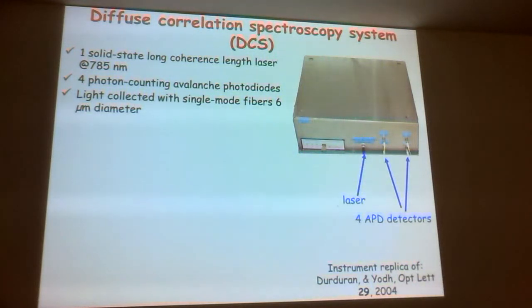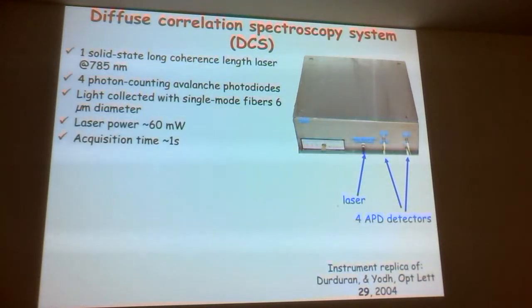Yeah. So when we do the measurements of Doppler, we do not measure in a single photon mode, and thus it's an analog signal, meaning we have a signal that's already averaged. When we use diffuse correlation spectroscopy, we look at single photon fluctuations in terms of intensity, and this technique is more sensitive for blood flow measurements than standard Doppler flow velocimetry. Those are simple technical issues, but they're important for the sensitivity.